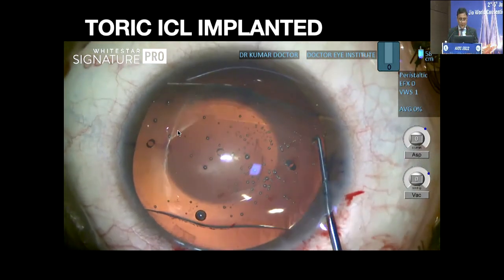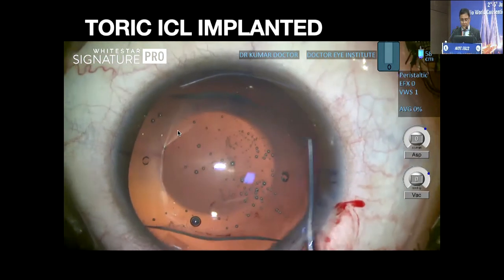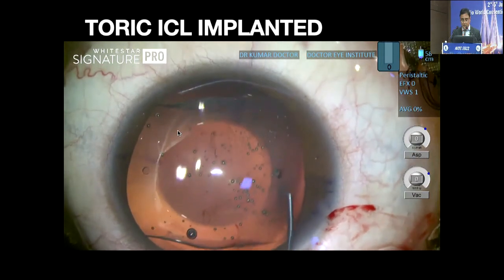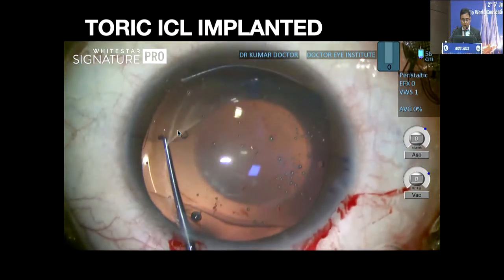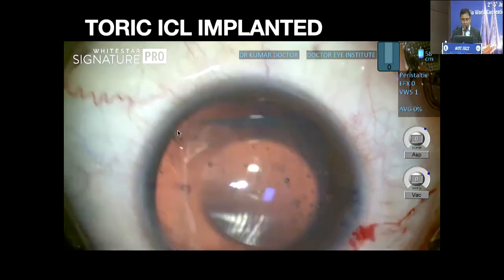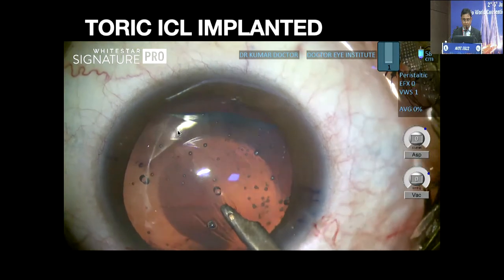And we align just the marks that is necessary. So high astigmatism, this is just 10 degree of placement, so there's not much rotation from the 180. Once one side of the plate goes behind, the other side of the plate goes behind. Any methylcellulose I like to wash with Simcoes, our old favorite, and you can even go beneath the lens. I just keep irrigating and it just keeps flowing out.